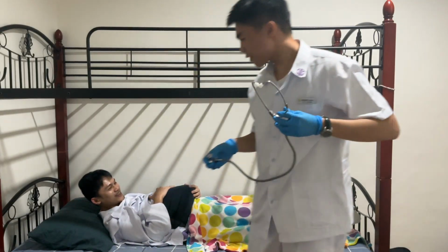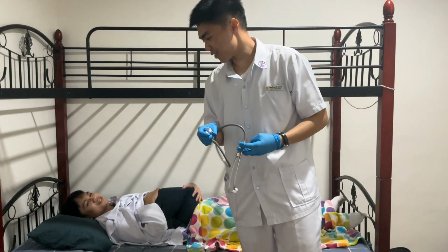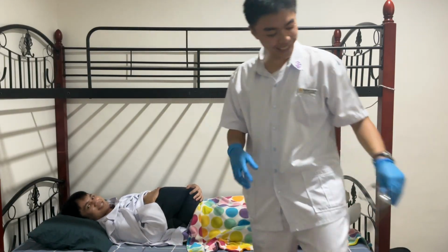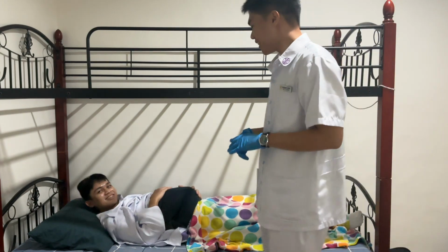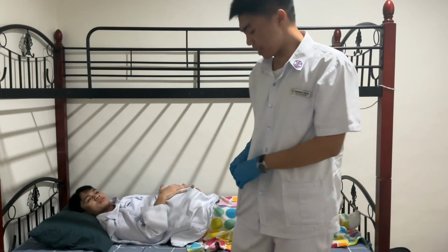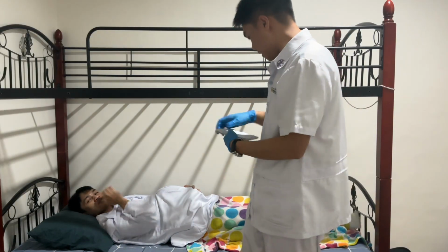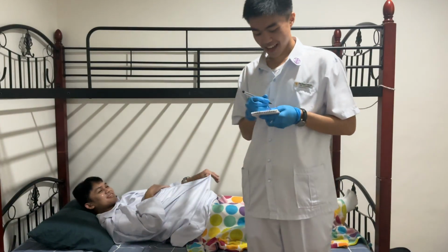So, do you know the gender of your baby, or do you want to keep it a secret until she comes? She's a she. Okay. So, female pala si baby. I'm just going to cover it back, ma'am. So, the normal is 110 to 160. And as I've said, it is at 120 beats per minute.